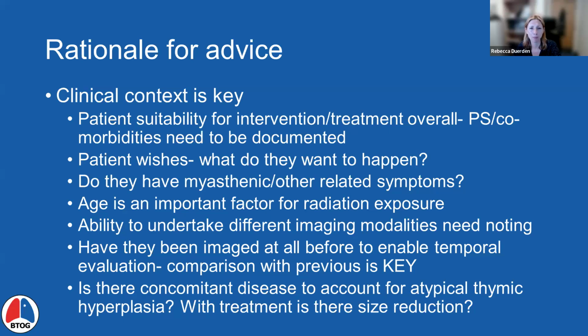And then very importantly, we need to think about the patient's age. Obviously, younger patients do get thymic lesions. So if we can do a low dose or no dose procedure to further image and follow up, that should be taken into consideration. We have to make sure that we've got an understanding of whether or not different imaging modalities can be used. For example, patients with pacemakers may not be able to go in an MRI scanner depending on the location that is scanning them. And also you need to think about things like claustrophobia for MRI.